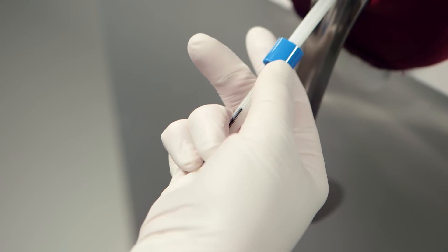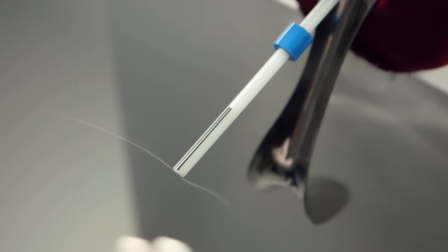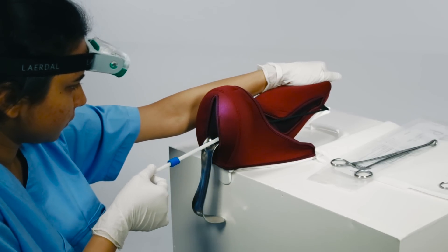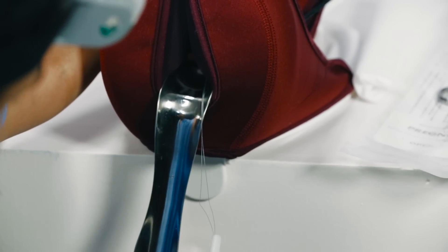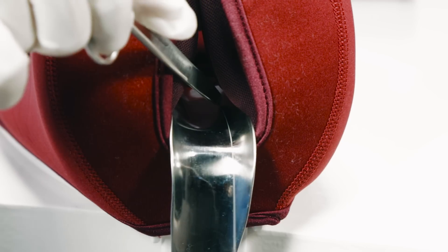Move the flange upwards to release the threads. Make sure the threads are completely free before removing the inserter sleeve. Maintain the position of the uterus by pressing on it as you remove the inserter. Cut the strings right at or just inside of the cervical os.